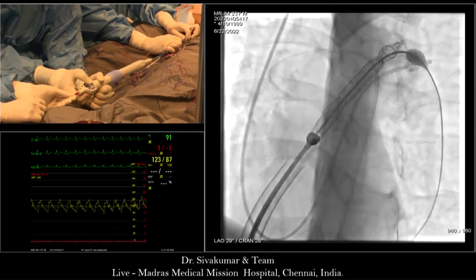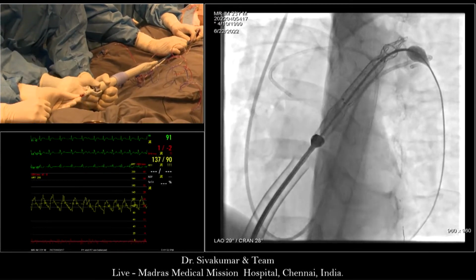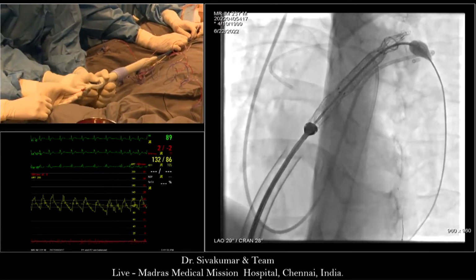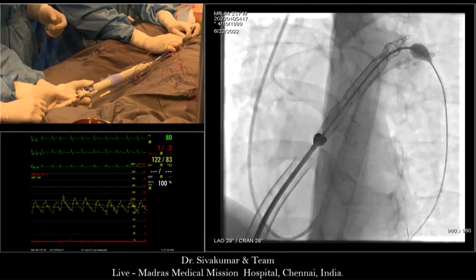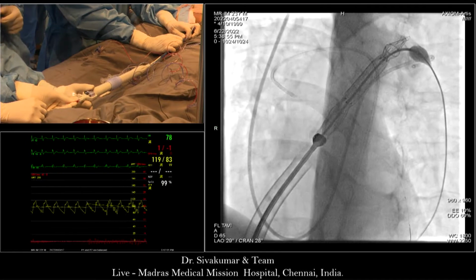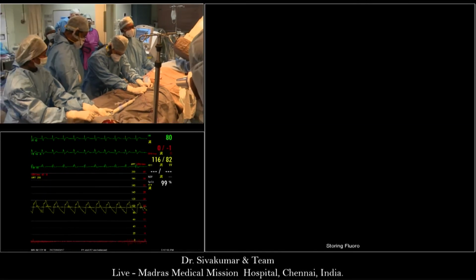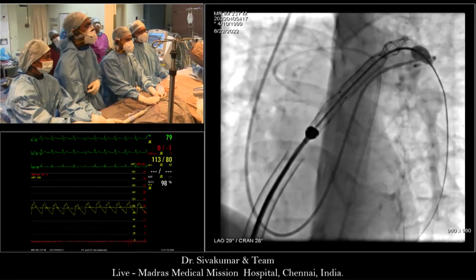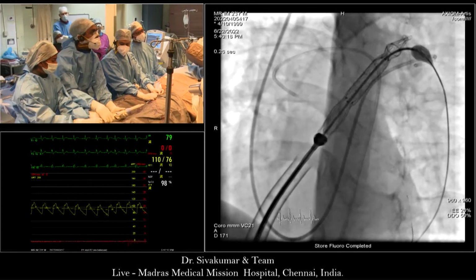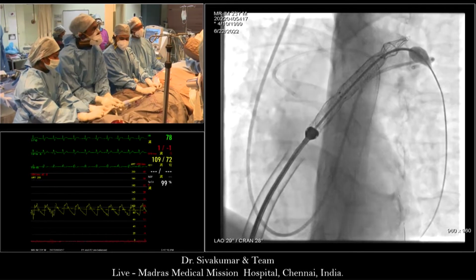I would pull it back because I don't trust myself. I think if you trap the pigtail distal part in the flare, then you've got a little bit of fiddling around. Can you give one more angiogram? 10 ml at 15 rate. Okay. I will do that, Shaq.